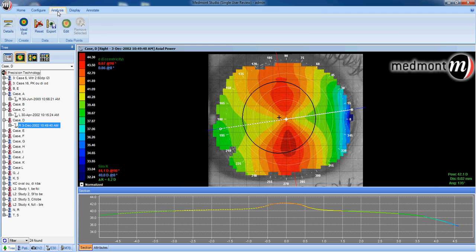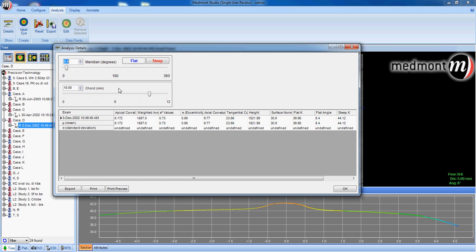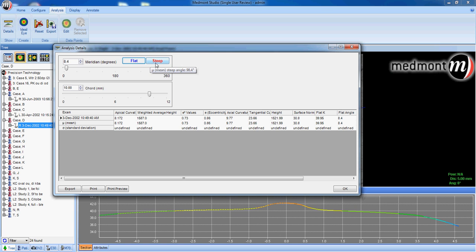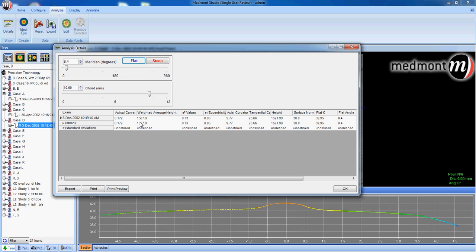When you have a limbus-to-limbus corneal astigmat, you may want to click on the analysis and details and compare the weighted average height or the sagittal depth in the flat meridian versus the steep meridian. Notice 1587 microns on the flat and 1825 microns on the steep.